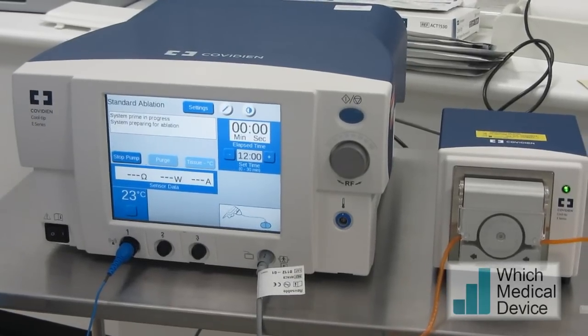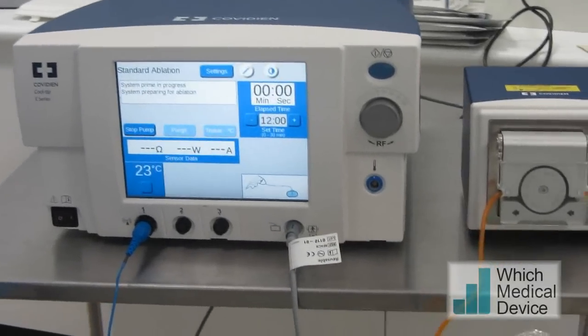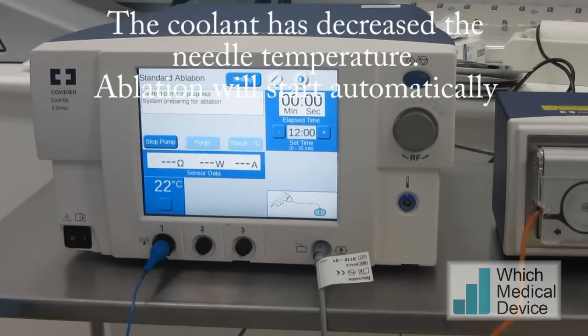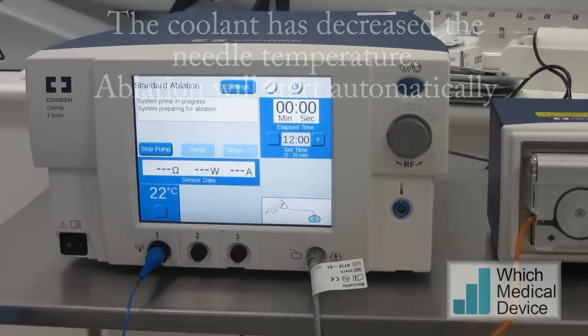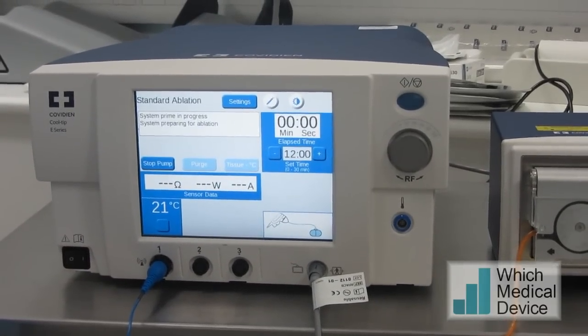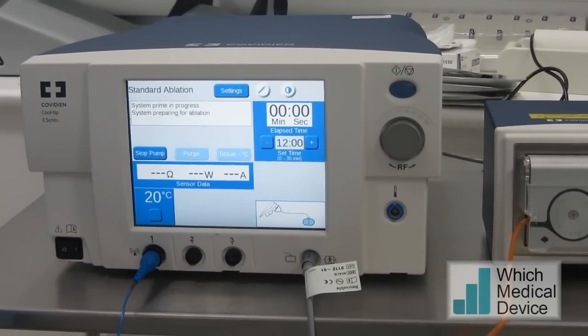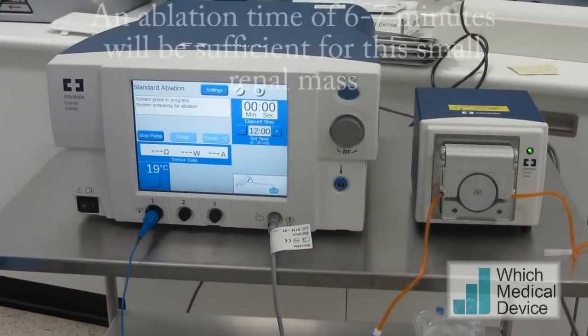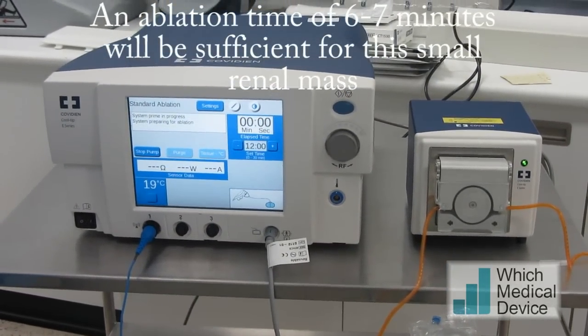The temperature immediately drops down from the 37 degrees of the patient as all the fluid pumps through, dropping the temperature right down. Once the system is primed and all the air is out of the system, the ablation will start automatically. The ablation is set for 12 minutes, but given the size of this lesion, 12 minutes will likely be too long and we'll be able to cut it down to about six or seven minutes.